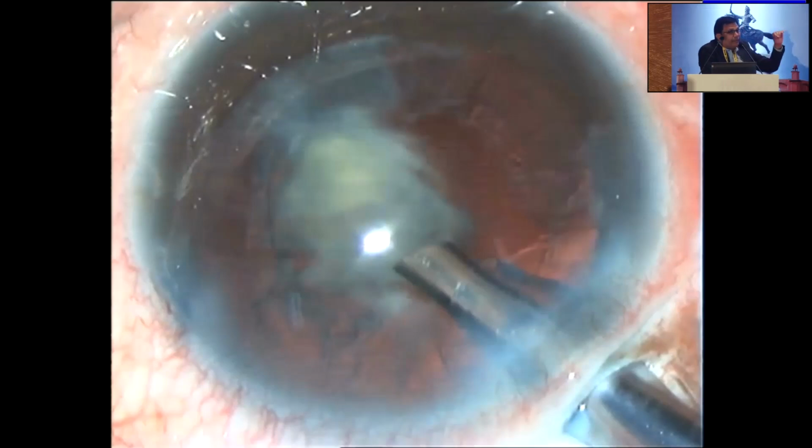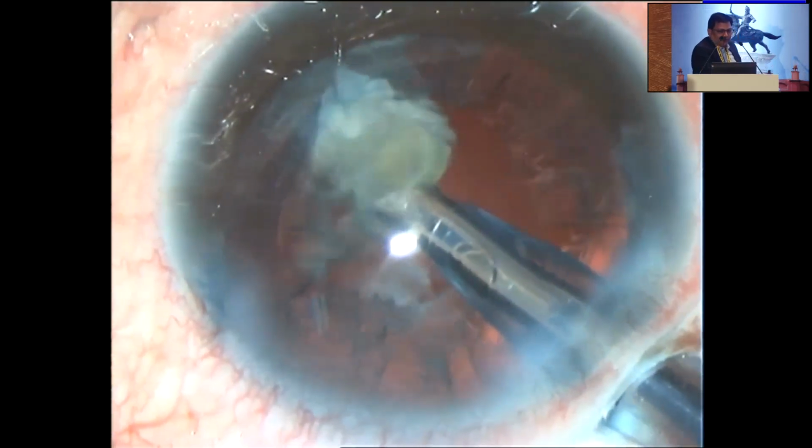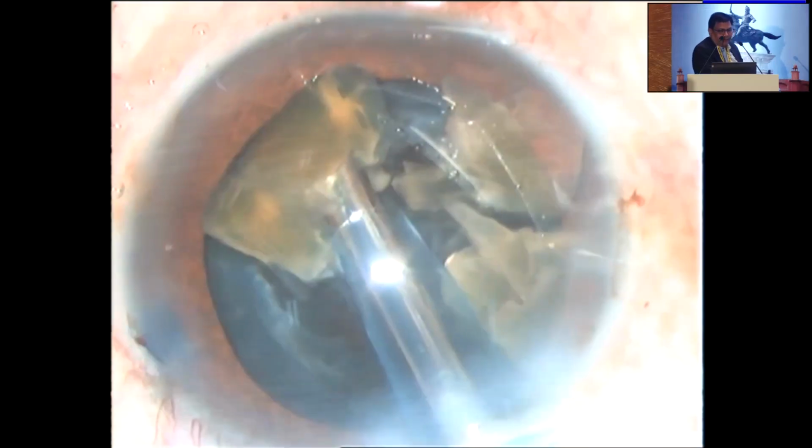So this is very important. Too many pieces, too many instruments, too many incisions will cut off the flow rate. If only the phaco tip is in the eye, it will work perfectly. Flow rate depends on instrumentation. If pieces are not coming, you can increase it to 30, 36, 40, but it is not correct practice. So one phaco tip, remove the pieces.